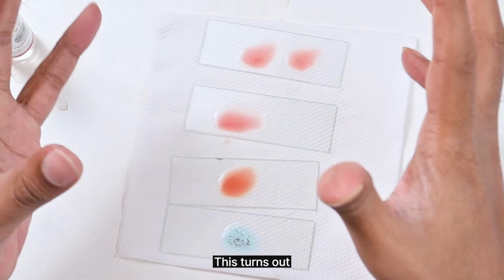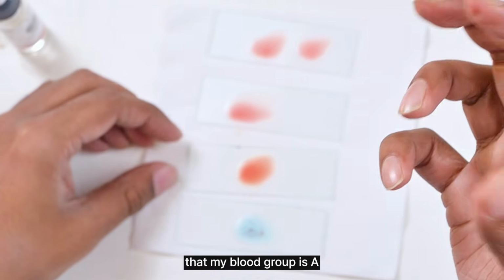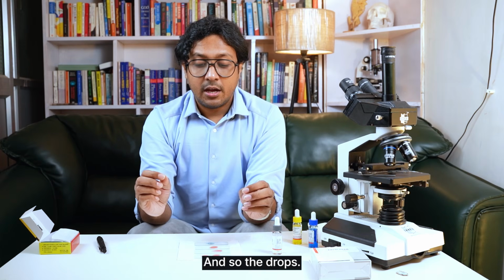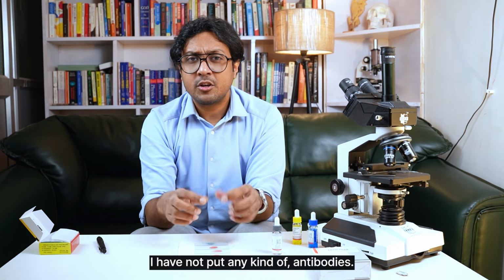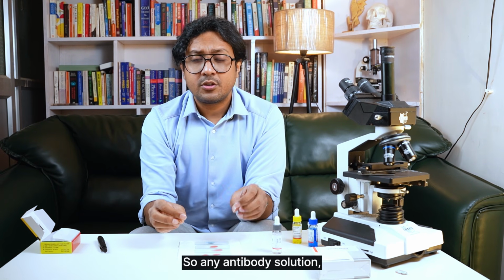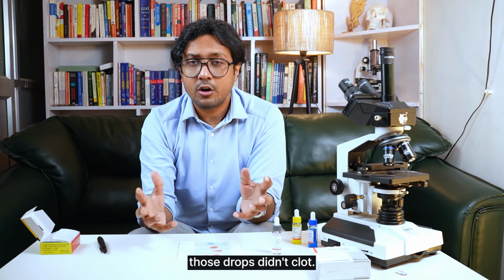This turns out that my blood group is A and Rh negative. And the drops where I have not put any antibody solution didn't clot.